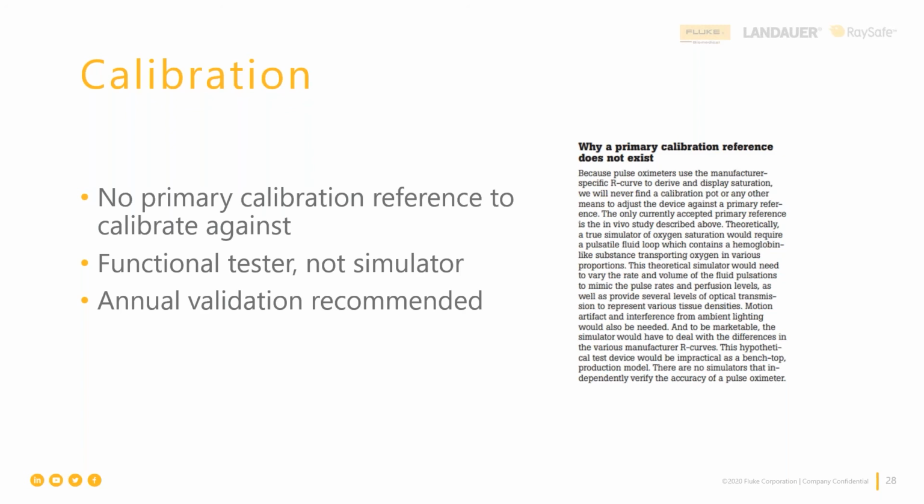It's part of when you send your ProSim 8 or ProSim Spotlight back to us. It's going to be part of what we look at, and it's called calibration, but it's not really so much a calibration. There might be some adjustments to displays and so forth, but that's about it. So it's all based on the R curve.